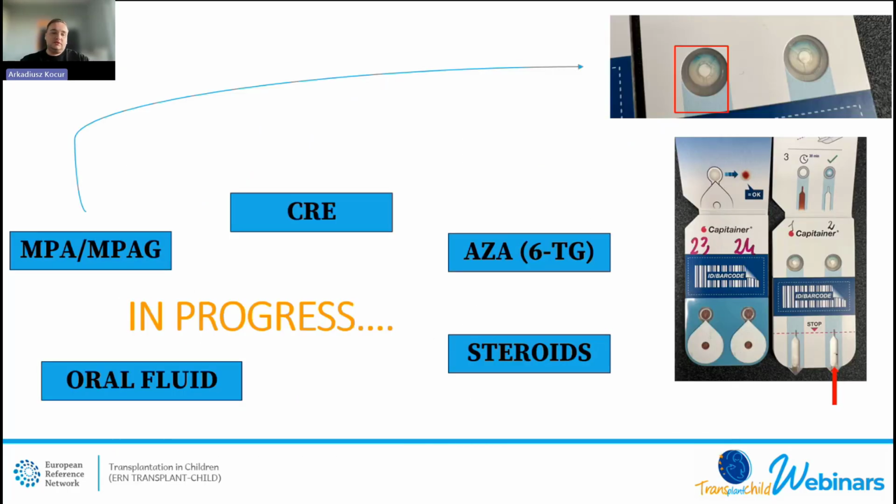In progress or after finishing are some of our other applications. We try to collect oral fluid, saliva, using MITRA-VAMS. It's possible, and the equality between the classic saliva system and VAMS is acceptable.